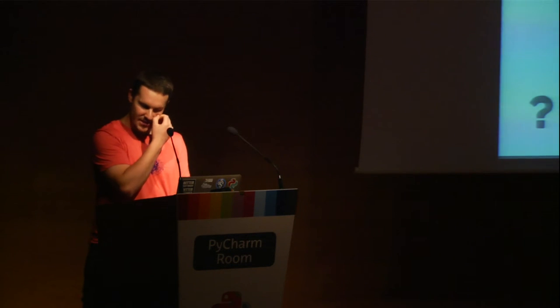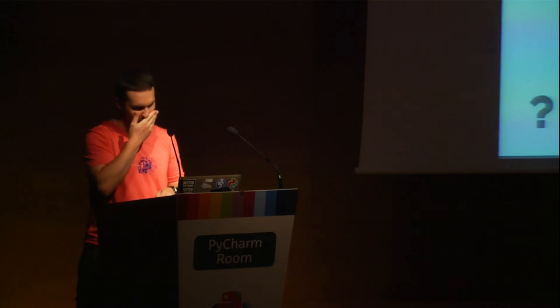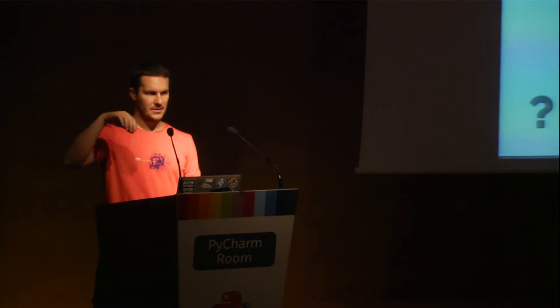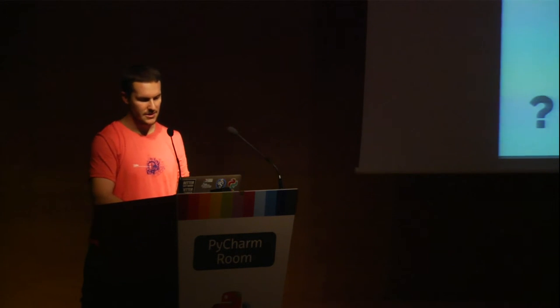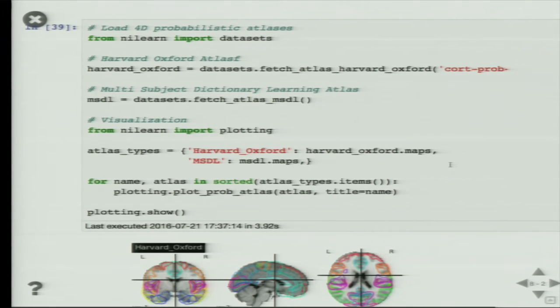So connectivity analysis is when you take this filtered smooth functional image and you select different regions, usually different anatomical regions. You extract the signal of each of these regions, and you calculate the covariance between these regions. So a covariance of the resting state data between these regions. And for that, you usually need a brain atlas. So an atlas gives you regions in the brain that are anatomically or functionally relevant.